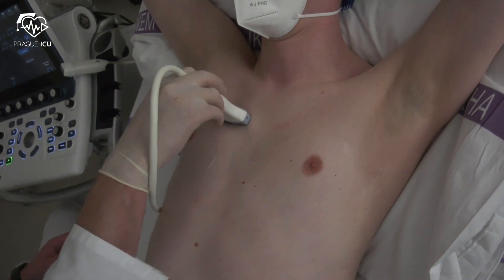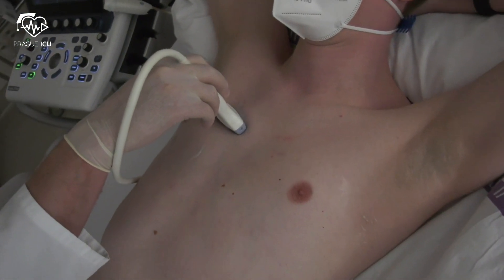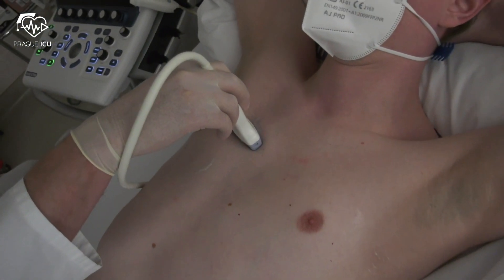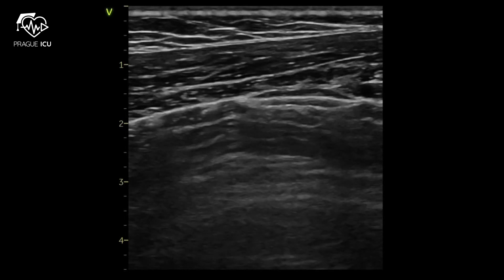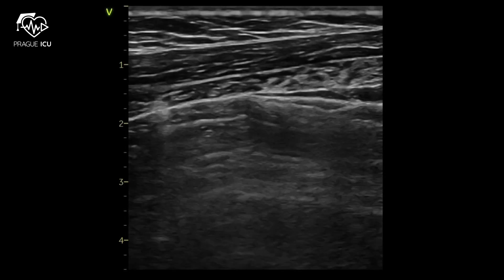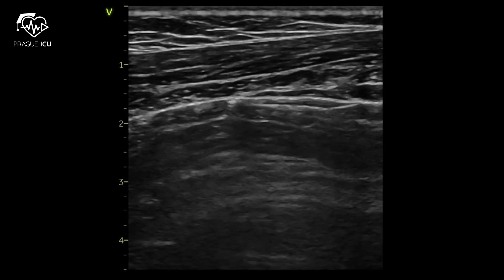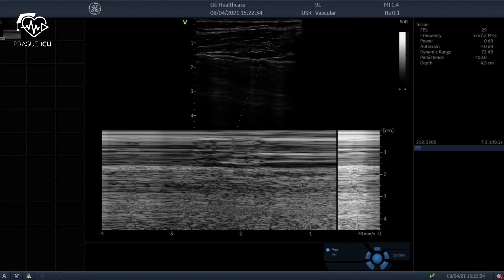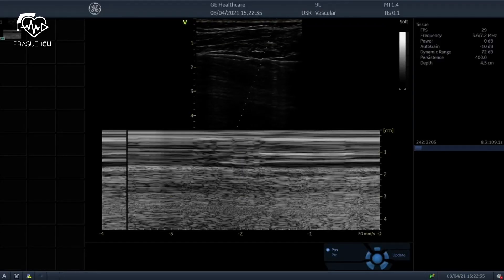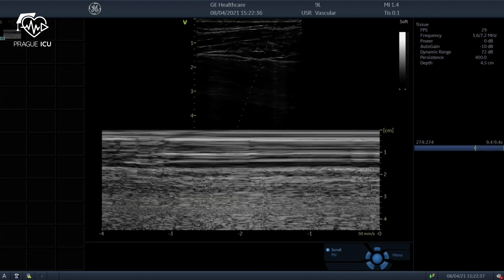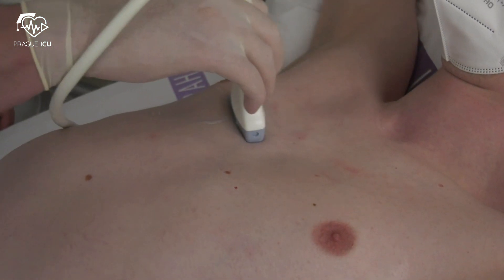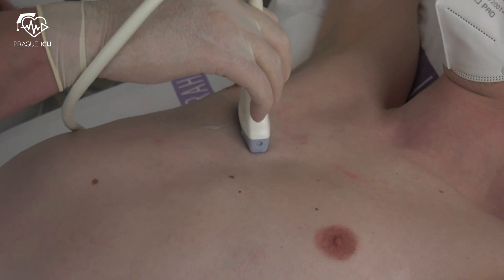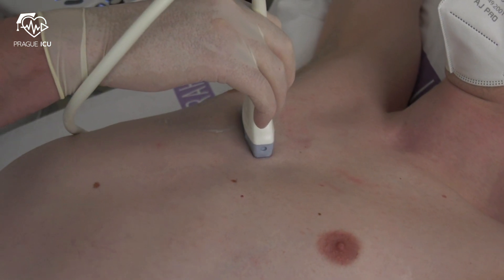We can rotate the transducer into the transverse plane, which will provide a perfect view of pleural sliding itself. The seashore sign on M-mode confirms the absence of pneumothorax. When looking for a possible pneumothorax, we should scan as many intercostal spaces as possible.